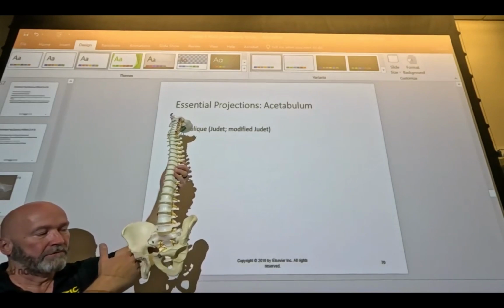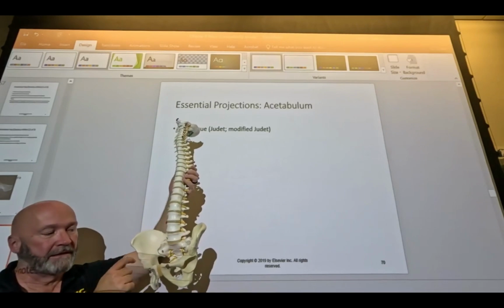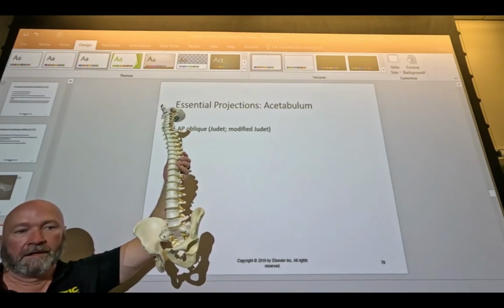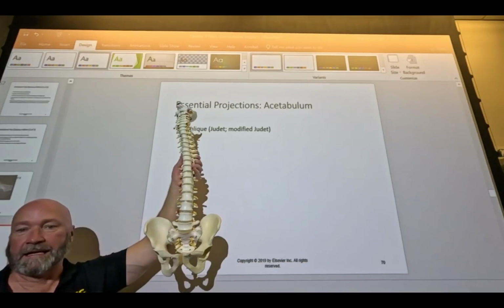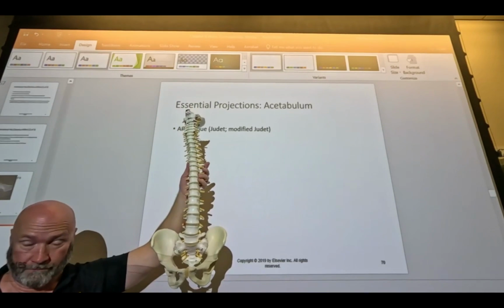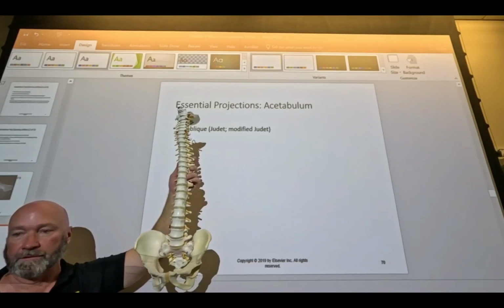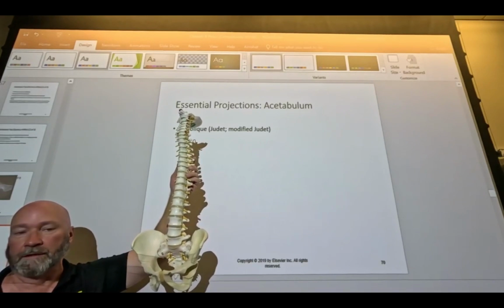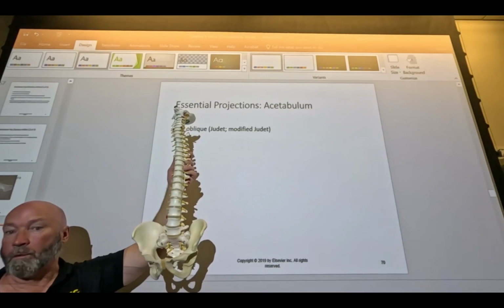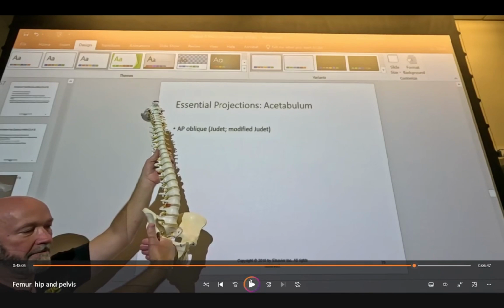All right. So it's bilateral obliques, and what I mentioned in class on Monday is that every doctor I've ever worked with did not want us to use the 10 by 12 field size. What the doctor wanted us to do was to shoot it like a pelvis. The reason for that is because with two obliques, an LPO and an RPO, we'll be able to see the entire pelvis. So if you're looking at the video, what you see is, let me stop it right there.